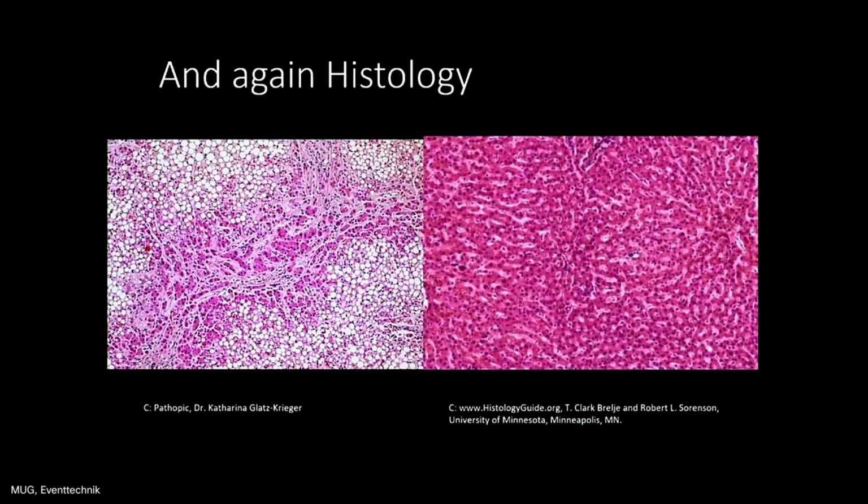And this is why in hepatic steatosis, we have, again, a lot of changes of impedance. And between every change, there's an impedance step, and it generates an echo. And so from the hepatic steatosis, we get more echo, which results in a brighter image. Nice to see a learning experience.